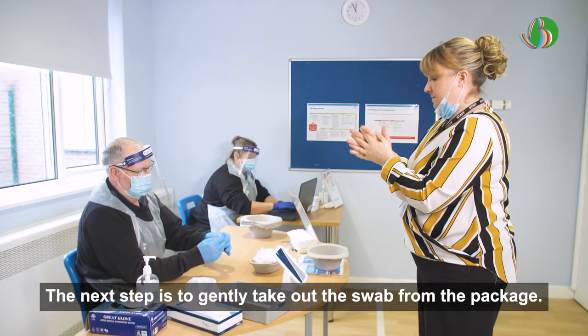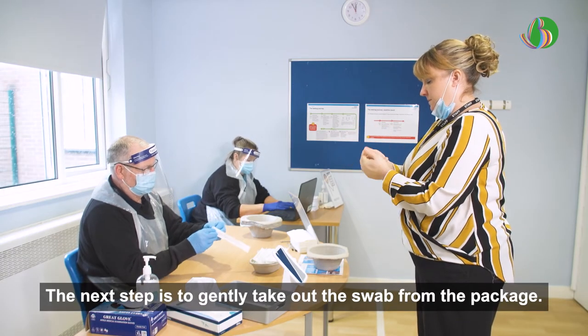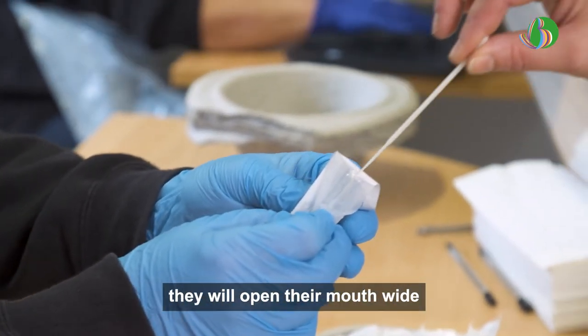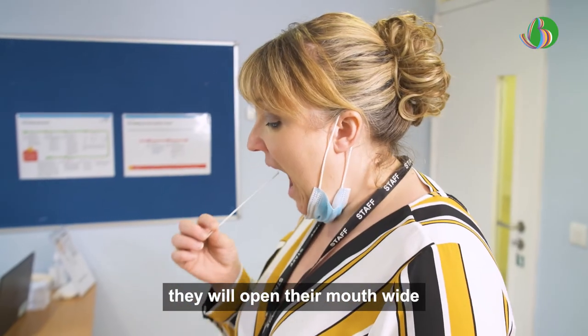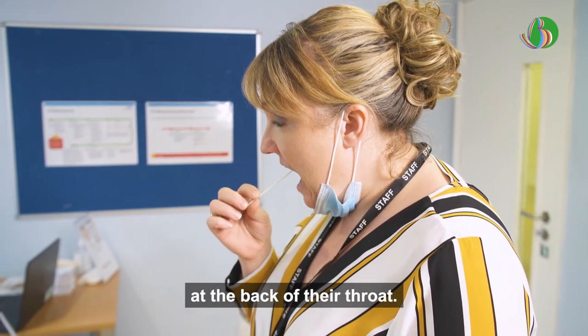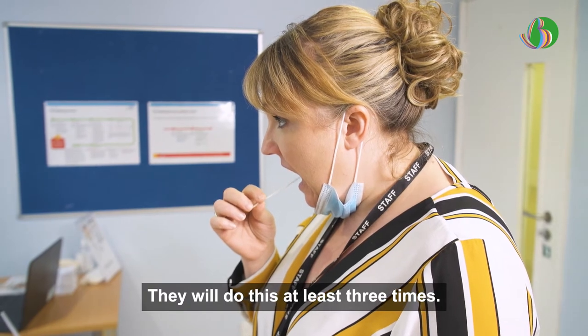The next step is to gently take out the swab from the package. This will be used for both throat and nose. They will open their mouth wide and rub the fabric tip of the swab over both tonsils at the back of their throat. They will do this at least three times.